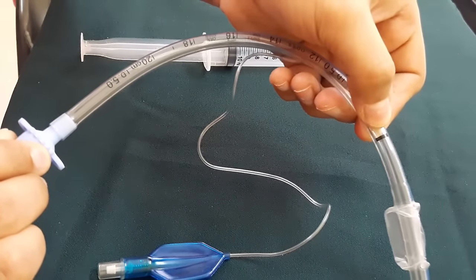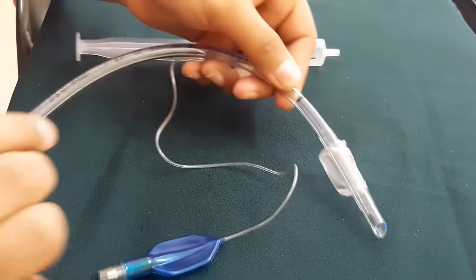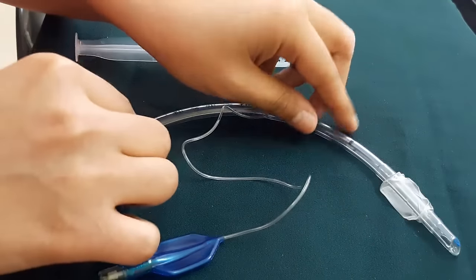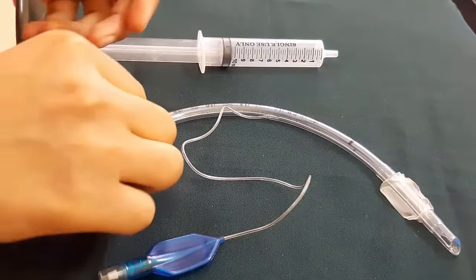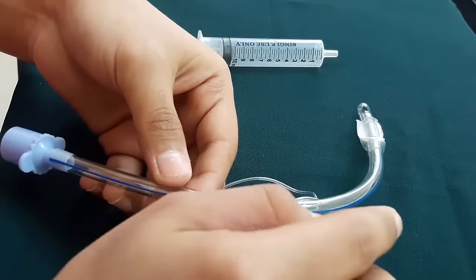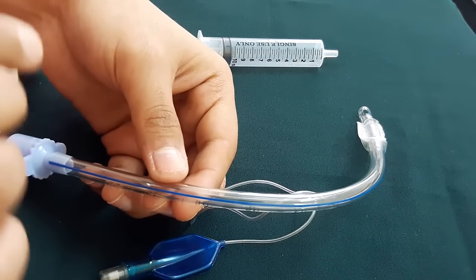The vocal cord guide is the black line on the tube. It should be placed at the level of the opening of the vocal cords so that the tip of the ET tube is positioned above the bifurcation of the trachea. The second part in the central portion is the radio-opaque marker, which is essential for accurate visualization of the position of the ET tube within the trachea.